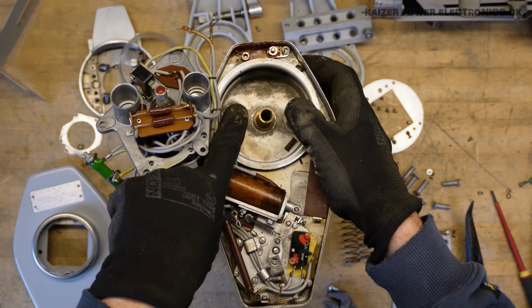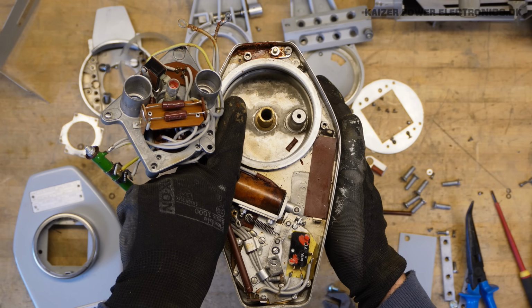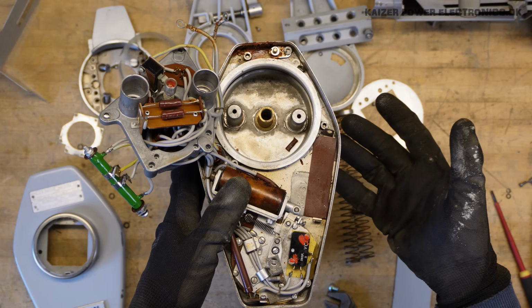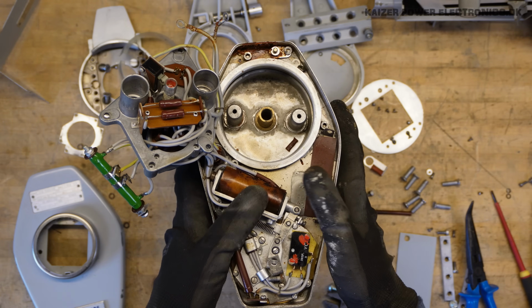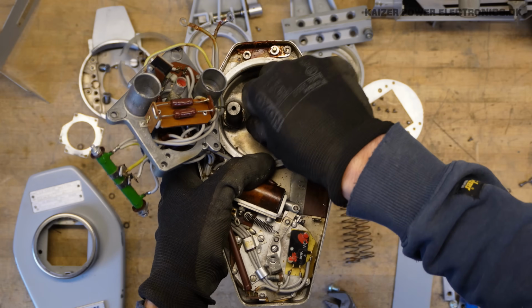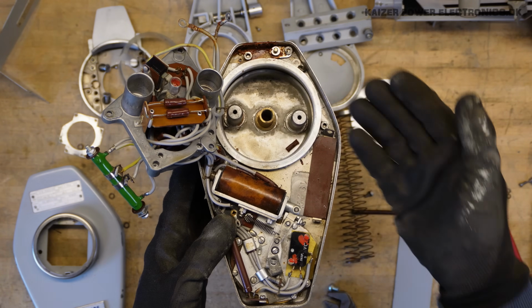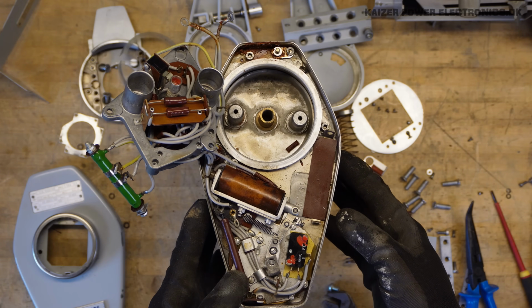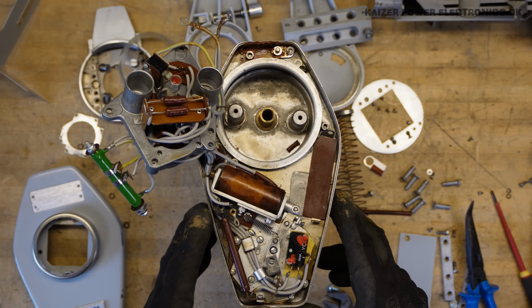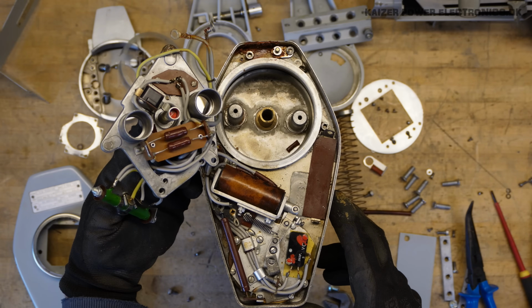Everything seems to go through over here. No, this actually seems to be some kind of expansion chamber. When this is used extensively, the transformer will heat up the oil, which will then expand, and that will have to go somewhere when it has to be an enclosed unit. So I think this is just an expansion chamber, and there's no way of pulling that up because I'm of course pulling against a vacuum. So we will still have to find somewhere to poke a hole. I'm also fearing now that getting this high voltage transformer to run outside of this could get a bit tricky.